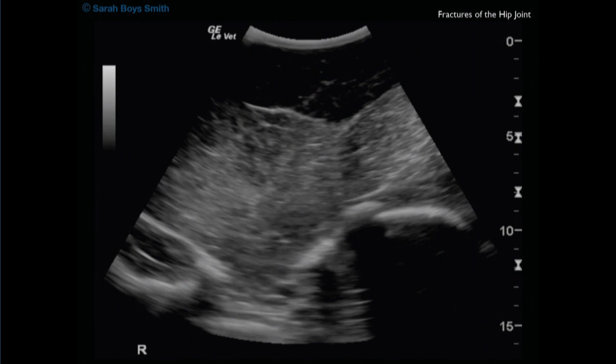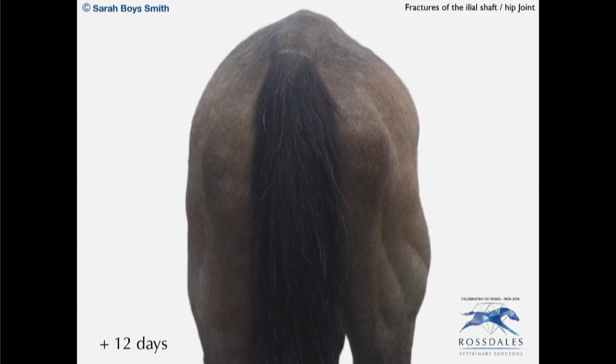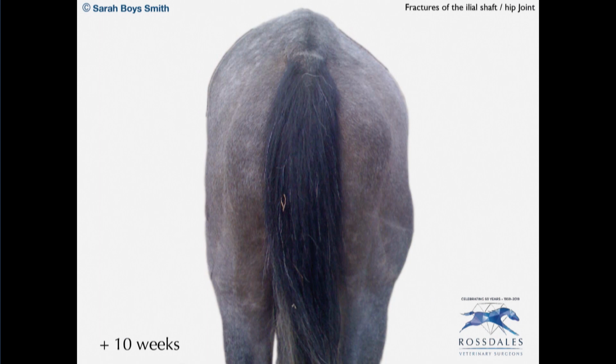So these ilial shaft fractures, they generally present in the chronic state with a lot more muscle atrophy compared to the ilial wing fractures. So this was the horse that we've just seen with that fracture extended down the ilial shaft. This is plus 12 days and then at 10 weeks. So we can see that we get a significant amount of muscle atrophy on these horses compared to the ilial wing stress fractures.